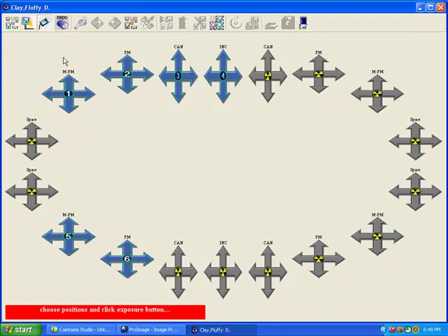Now, the last sequence that I chose started with the animal laying on its left side, taking the animal's upper right molar premolar. Second shot, we will go with the premolars. Take a shot of the upper right canine, and then the incisors, which are right in front. And then with it still laying on the same side, we'd go down to these mandibular and take the right rear molar premolars and the right rear premolars.